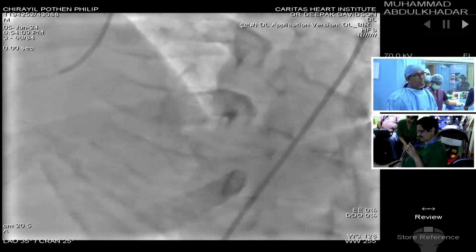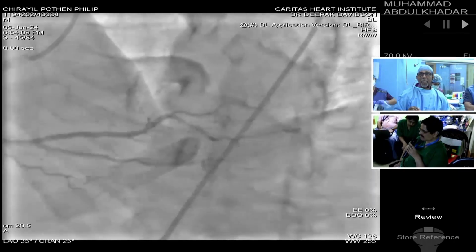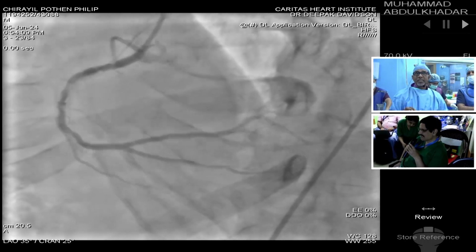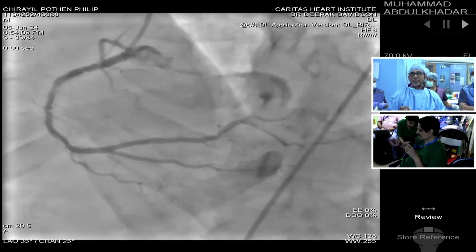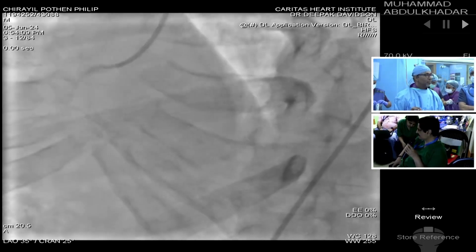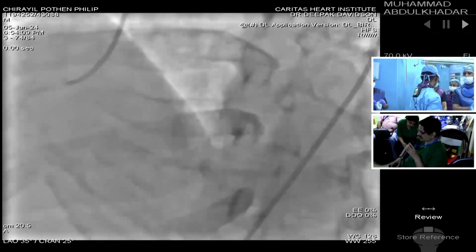Another thing I observed is that a 7 French JR usually gives a very supportive catheter like AR and AL. Very true. If you take 7 French, guide extension catheters are easy, and with 6 French there is free movement and exchange, along with balloon occlusion methods for easy removal of the microcatheters. All these methods will be easy.